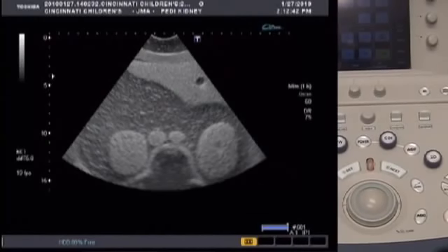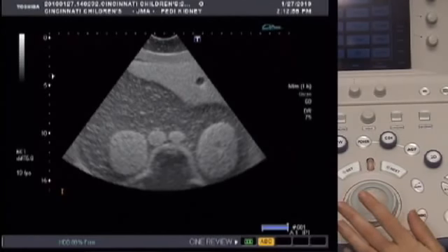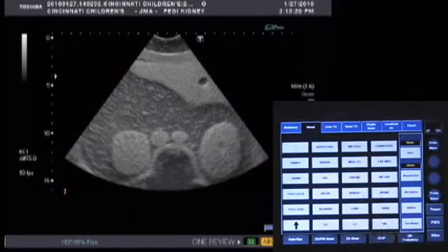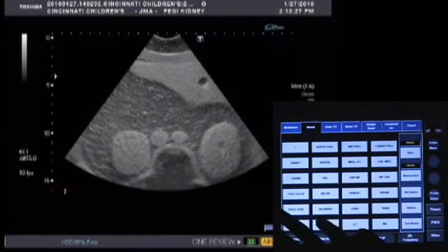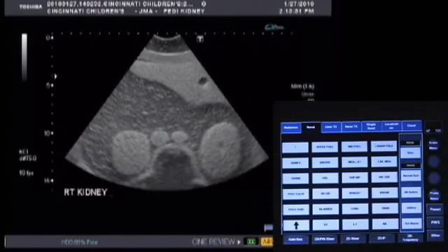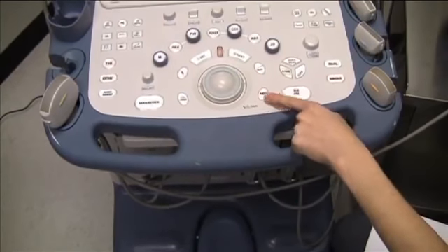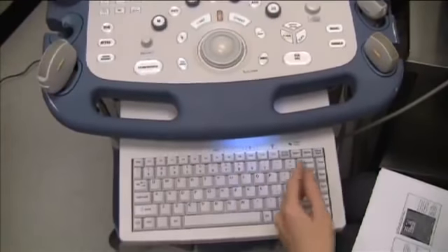Once your screen is frozen with your desired image, you can label it by pressing the ABC button. Move the trackball to the desired location on the screen — this is where your label will appear. Use the touch screen to label the image with preset options. We're going to label the right kidney by touching the Renal tab at the top, then selecting Right Kidney. To manually enter a label, press the ABC button again and use the keyboard under the control panel to type your desired label.